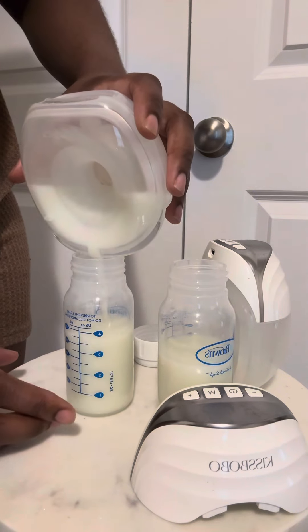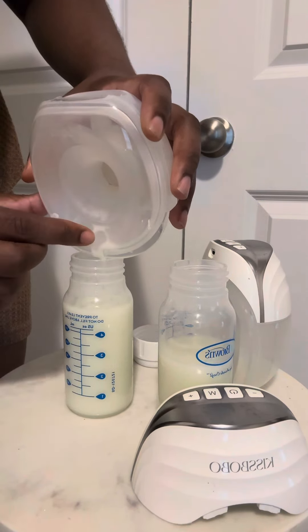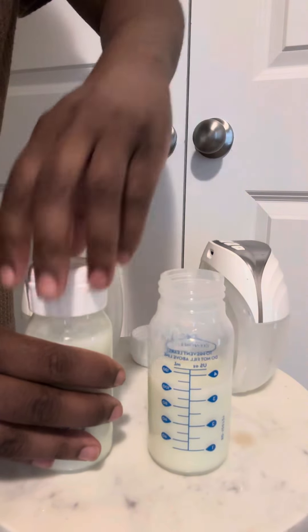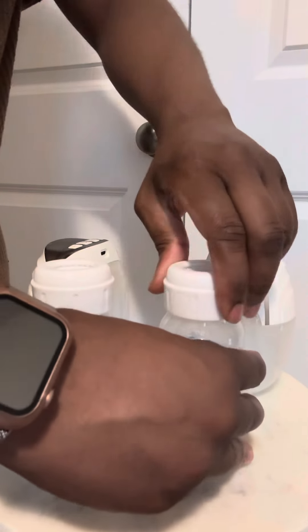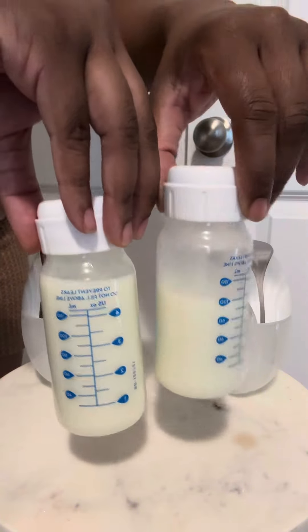It's pretty consistent with milk production. My left side is my overproducer and my right side produces a smaller amount, but nonetheless we are still reaching our daily pumping goals, and the GLE 10 by Kiss Bobo is making it happen. You need to get it and try it.